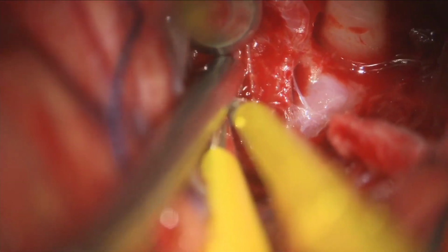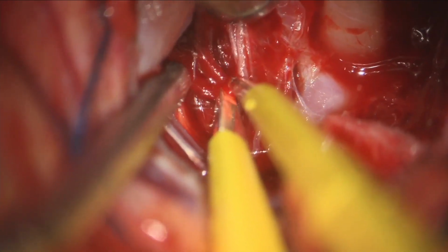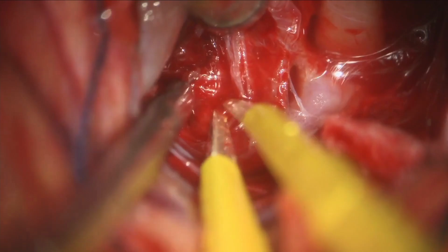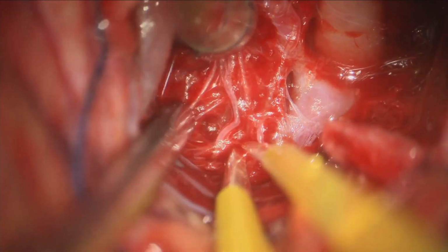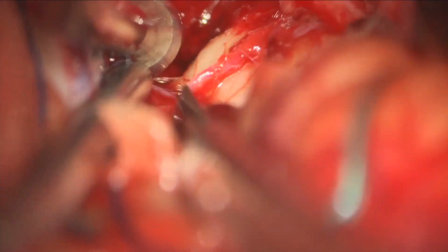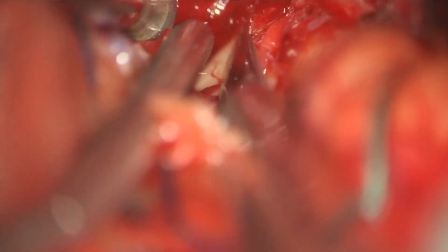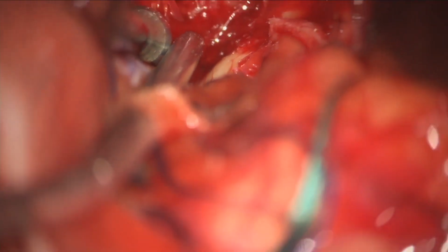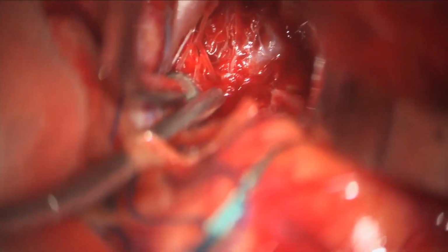And obviously this area is very dense with perforating arteries, and here also thick with subarachnoid blood, which made this work somewhat challenging. We split all remaining arachnoid adhesions to widen our working area. You can see the view here.